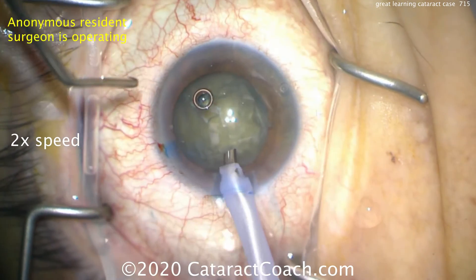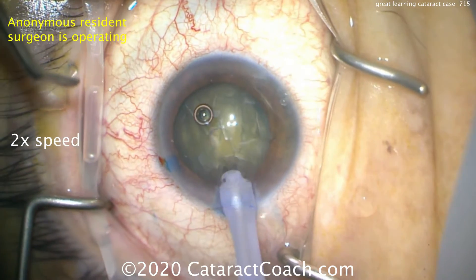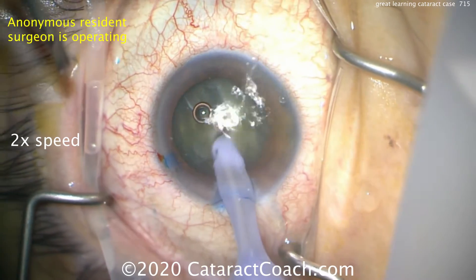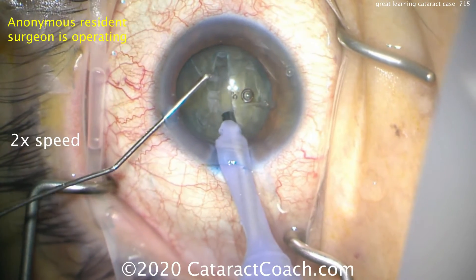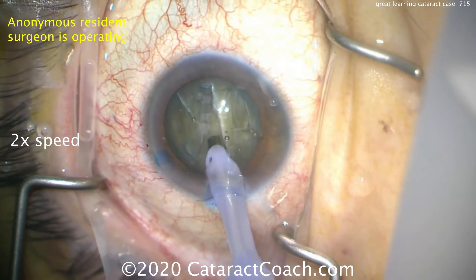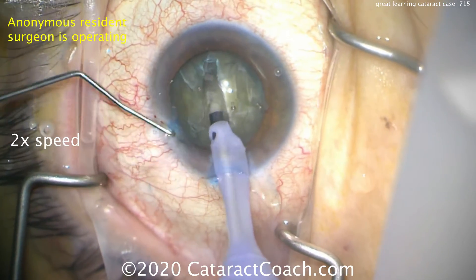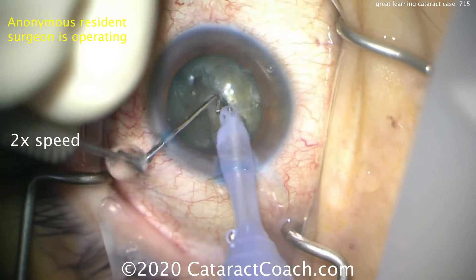Now let's see what kind of nucleus division we're going to do. That 19-gauge cannula pointing things out is me, and the resident is the one operating. Starting right in the center — looks like a groove. This will be a central groove and then a cracking technique to achieve the initial split of the nucleus into two halves. I'm helping by taking away those air bubbles; an experienced surgeon wouldn't mind them, you just look past them. But early in the learning curve, they can be distracting. The central nucleus is deeper, so that has to be sculpted deeper. That was pretty good.